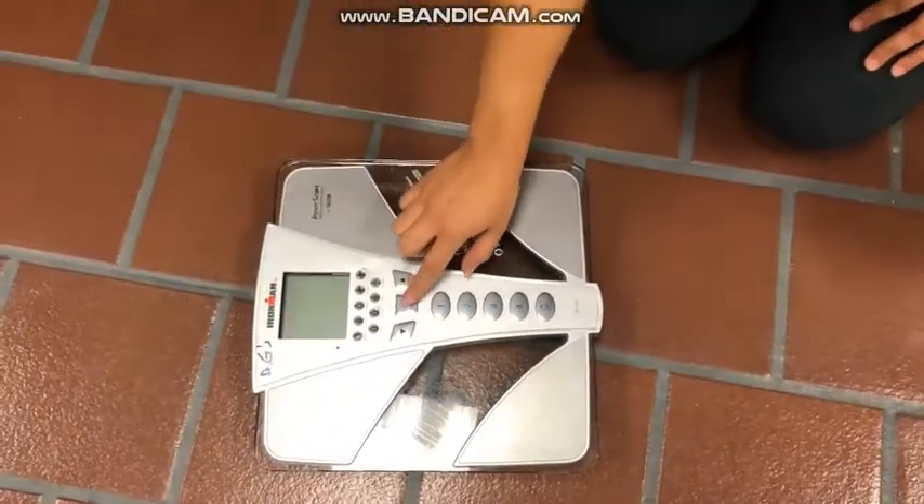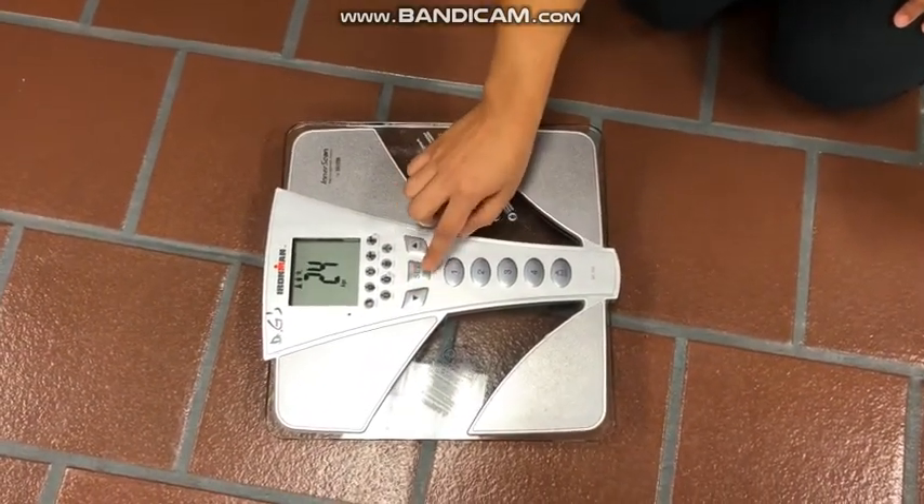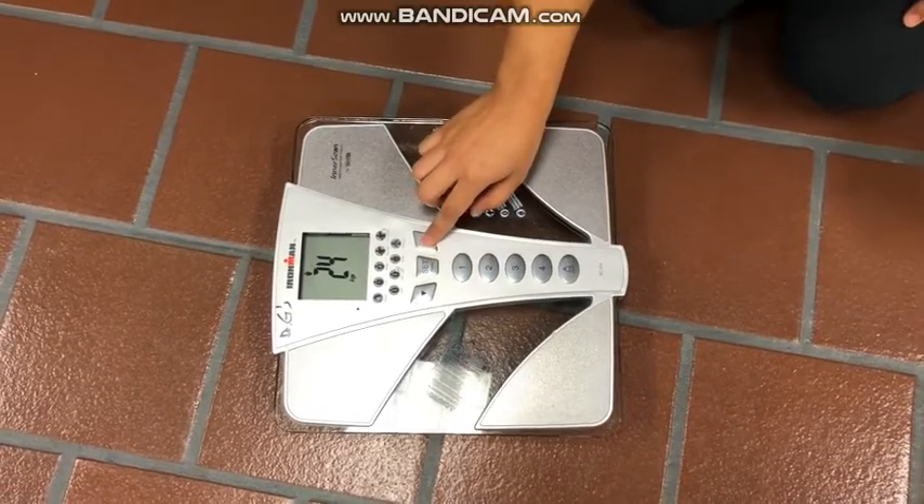The technician will then set the scale with the participant's information, such as their age, activity level, and height.